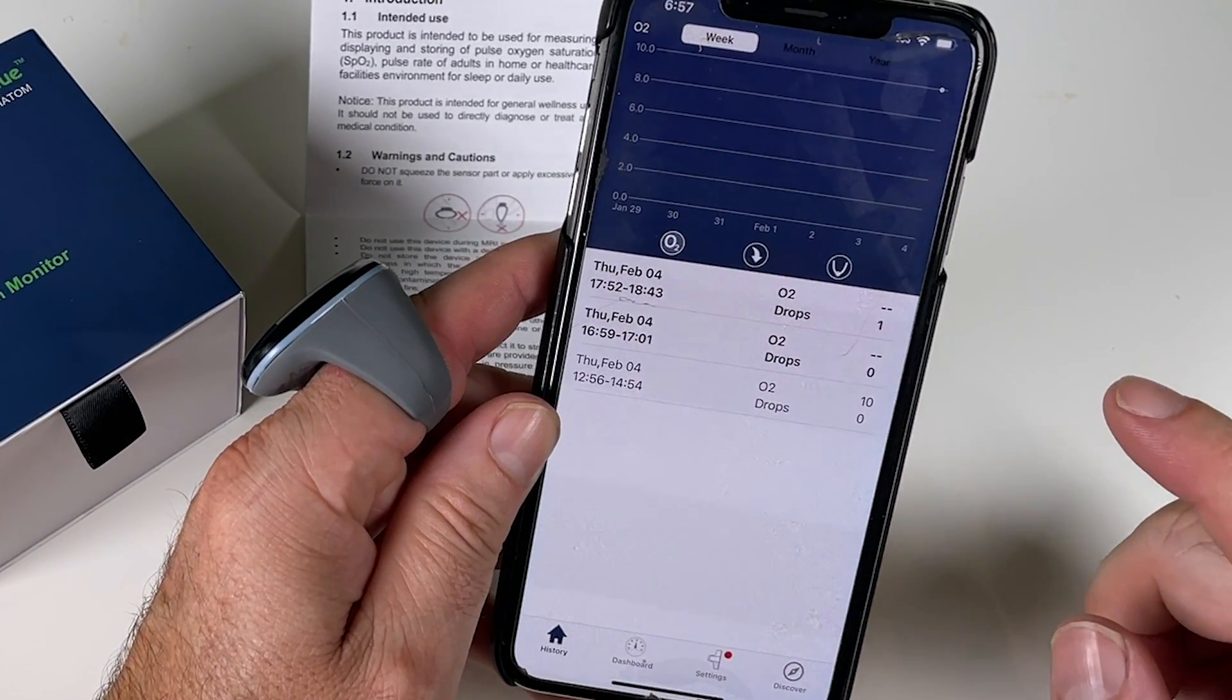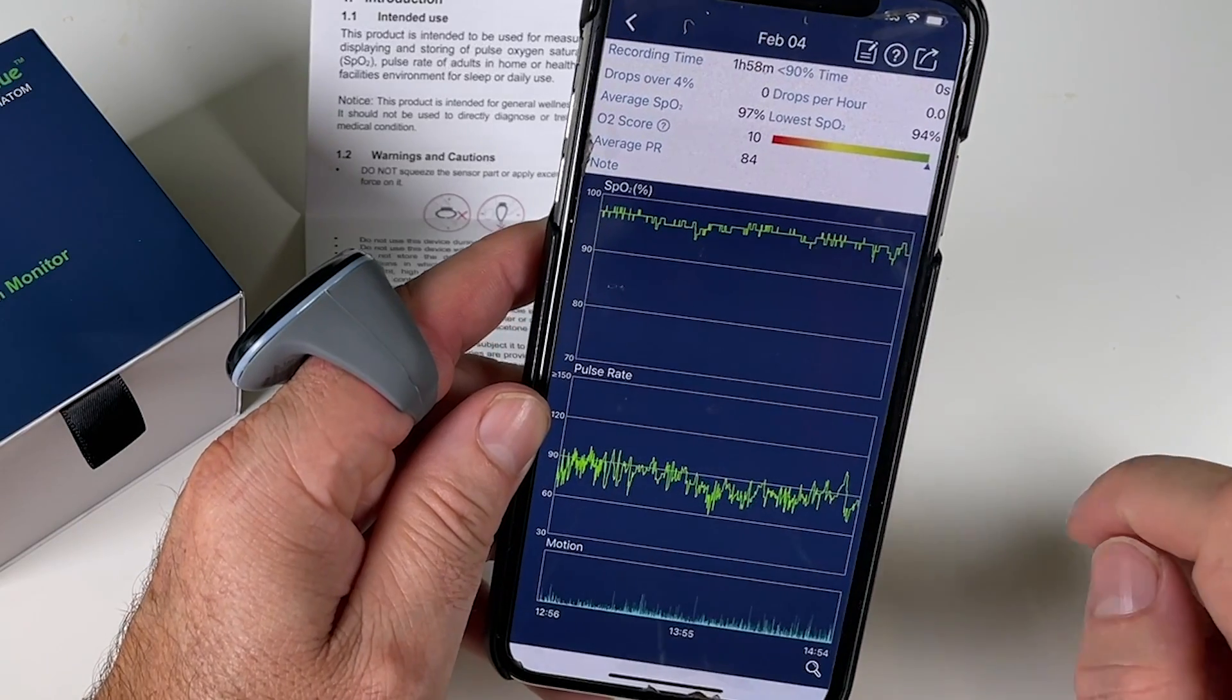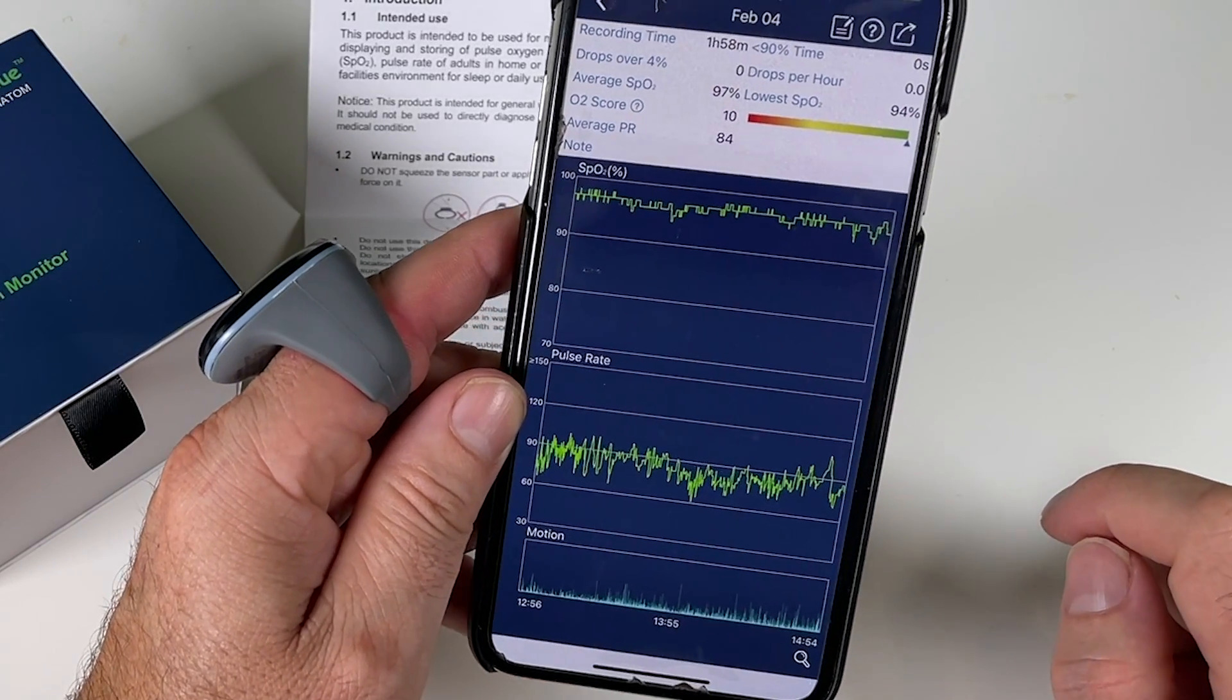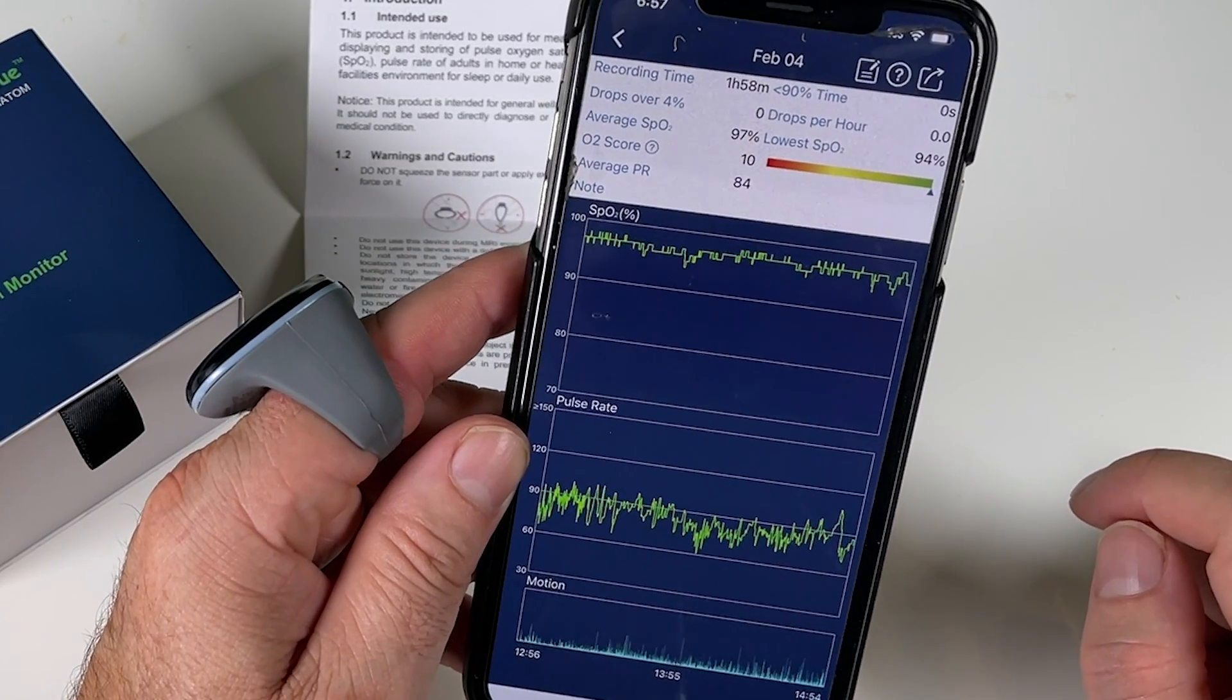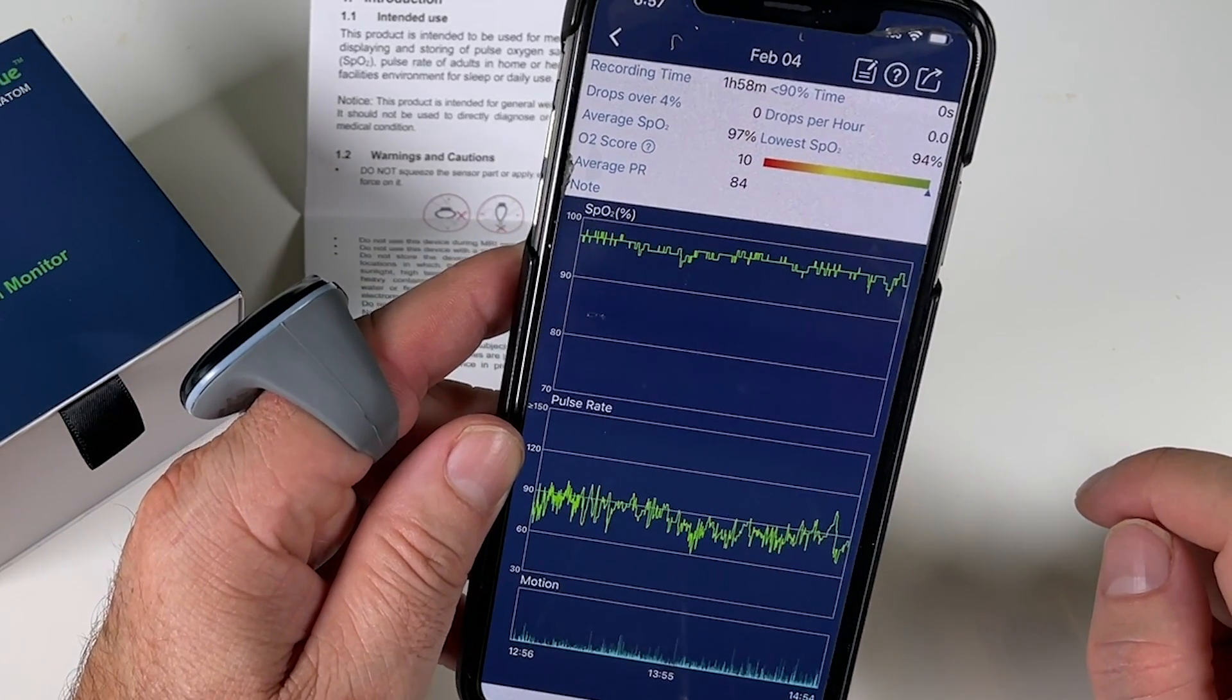So you can see here that this has already loaded some data that I already had on the ring from when I was just wearing it around earlier.